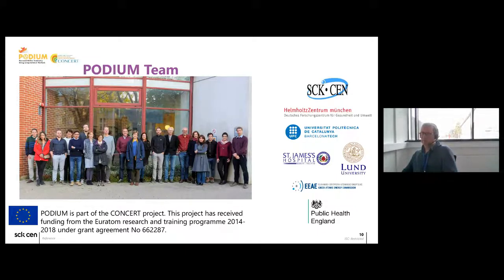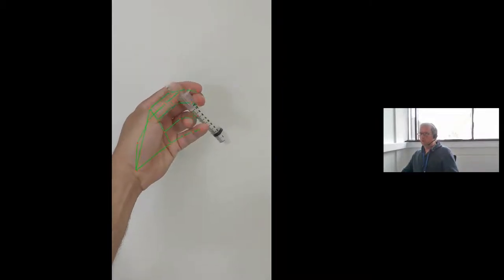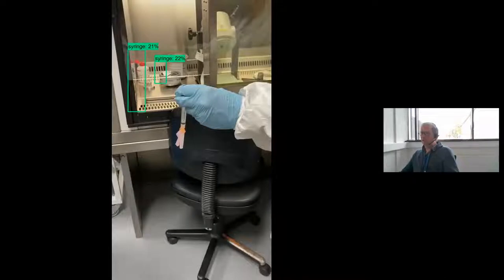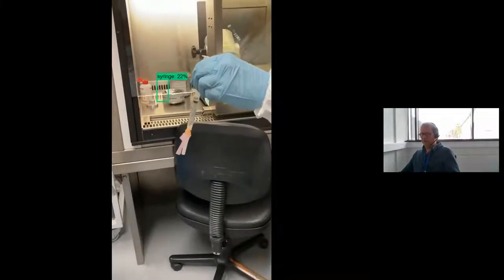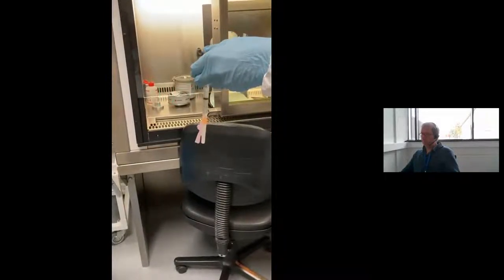And so the PODIUM project finished in 2020, but the different partners, and especially also in our institute, we continued working on this approach. We actually also have a PhD now working on applying this to nuclear medicine staff. I just want to show you a little bit of what we're working on, because that's a little bit different. Then you have to try to monitor the hands, and not only monitor the hands, but we want to actually track syringes, track vials. So we start using computer vision algorithms to recognize from normal camera images the things that we need to know to calculate the dose.